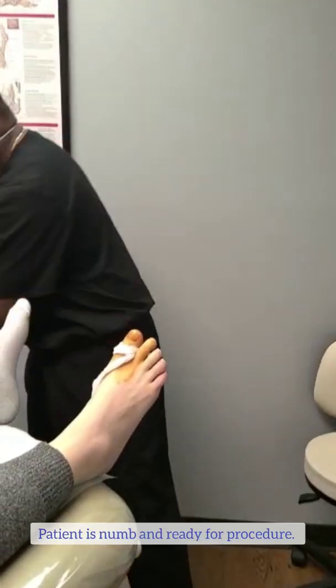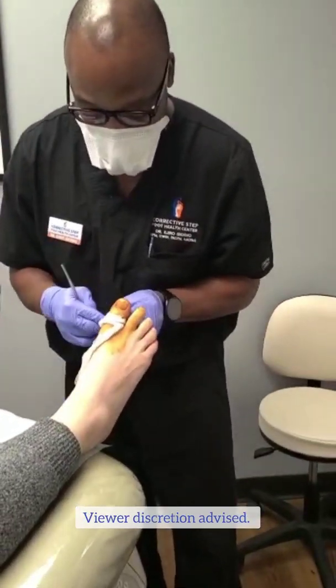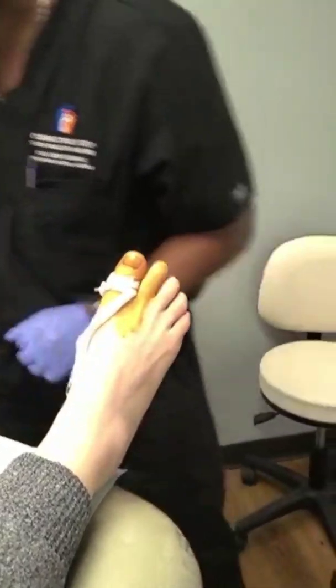Our patient is good and numb now, and we have our betadine prep on here. I'm going to make my homemade tourniquet. We use some gauze and then we're using a rubber band and a hemostat.